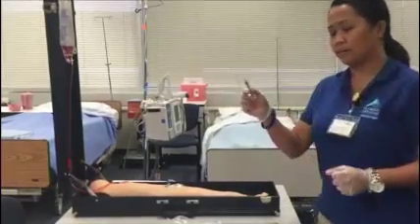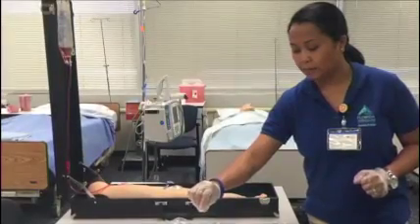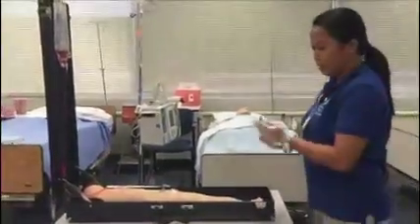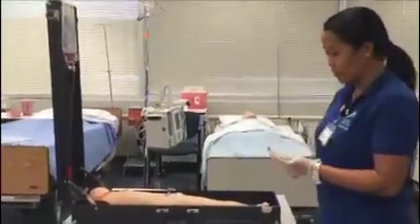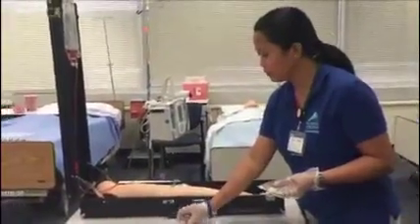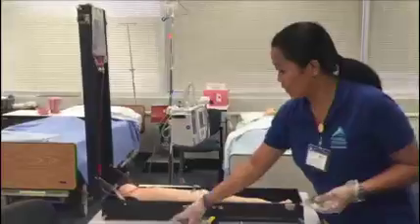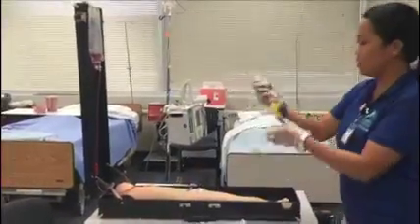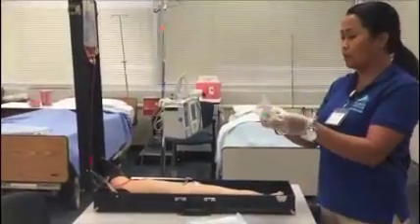I'm closing the needle and throwing it in the sharp container, and I'm mixing the medicine. The medicine is mixed, and since I already have the things up there, I'm going to grab this. This is still sterile. This is just coming from the bag, and the bag was closed.